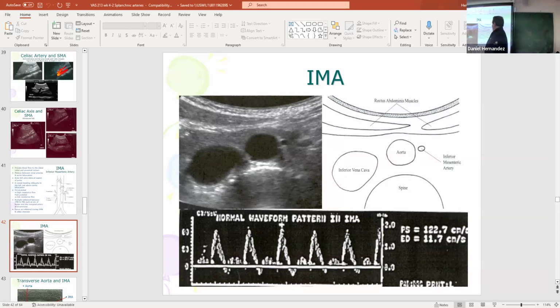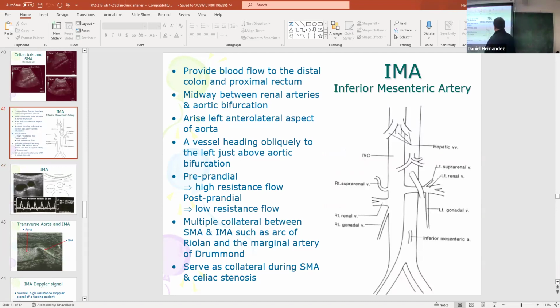You said this is like mid aorta? This is more distal aorta, so this is between where the renal arteries come up and that bifurcation. Probably just above your belly button, so right below renal. So your renal arteries were, is it on here? Yeah, they're on, so that's IVC. The renal arteries are gonna be right around here, so there's your bifurcation, IMA's kind of distal. Pretty distal.